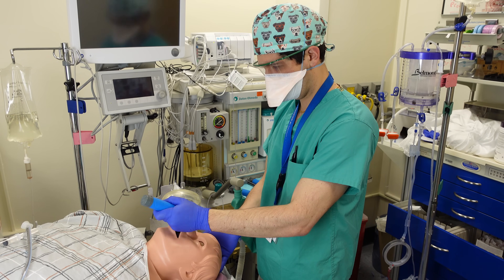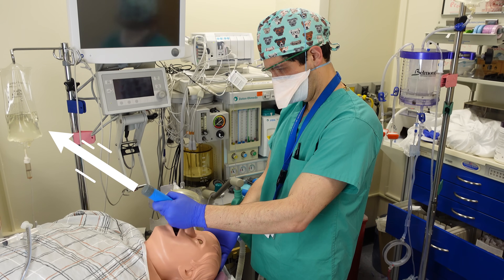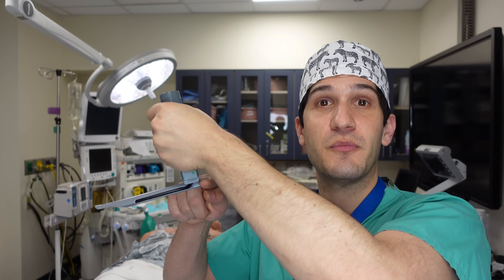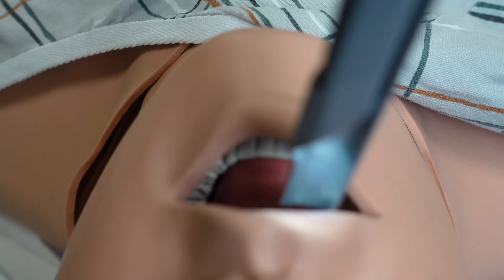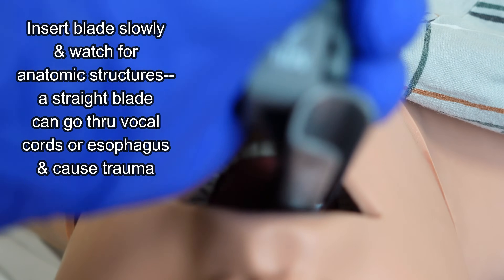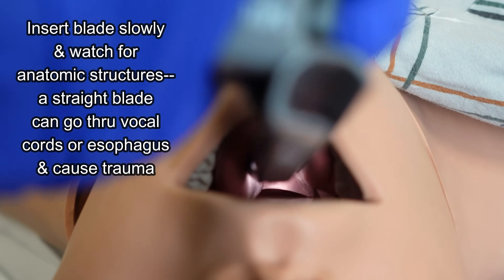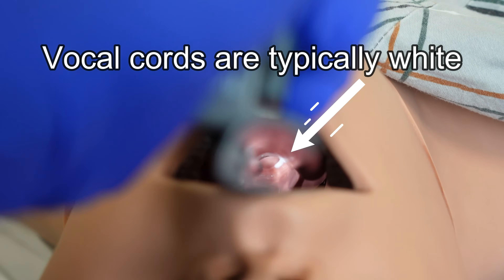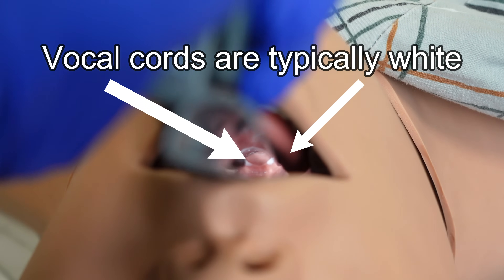As you're advancing your blade, you can start lifting your handle towards the back wall of the room, as we commonly say. It's really important to avoid cranking your blade back, which can make it much easier to bump the back of the blade into the patient's teeth. As you insert your blade, you're looking for the epiglottis — and with the Miller blade, you want to get directly underneath the epiglottis. It's not uncommon to insert a blade and just see epiglottis, in which case you may need to advance your blade a little bit, and then you can pick up the epiglottis and hopefully reveal the vocal cords immediately behind that.